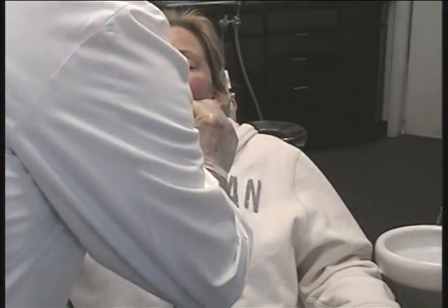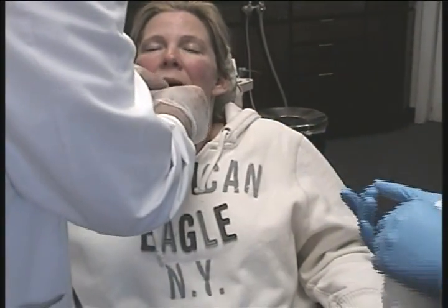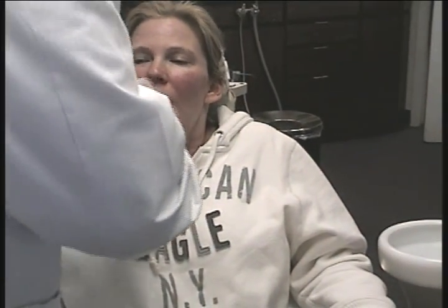I have had the patient using tongue blades in her mouth to determine what the vertical dimension is, so that I know at what vertical dimension to construct the lower splint. At this point in time, I am delivering the lower splint for the first time. Okay.